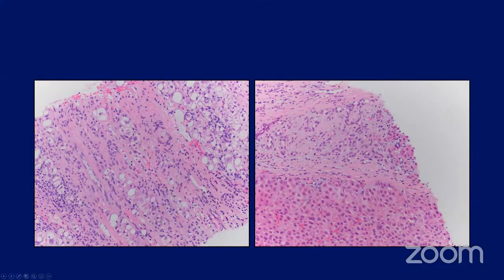And here you can see that this is the septal band, and there are some infiltrating tumor cells. So this is stromal invasion, and this is a higher power view of the stromal invasion. The tumor cells are infiltrating into the septal band. Here again you have this septal band or portal area, and you can see that there are infiltrating tumor cells. So stromal invasion, if seen, is definitely helpful in the diagnosis of a hepatocellular carcinoma.